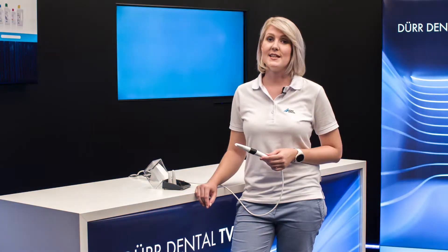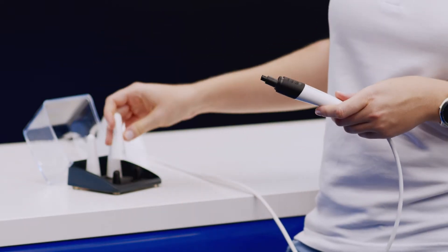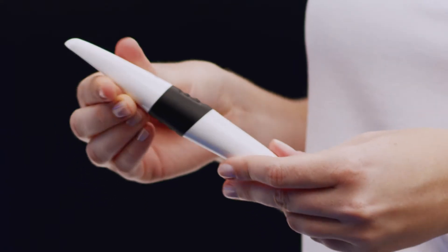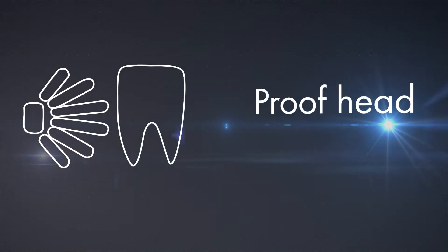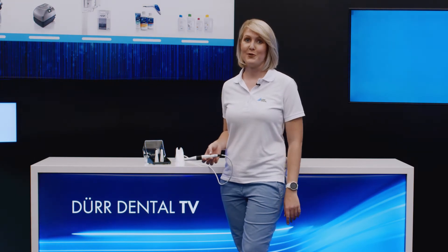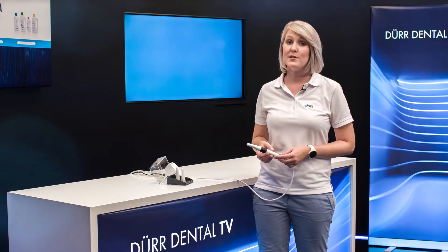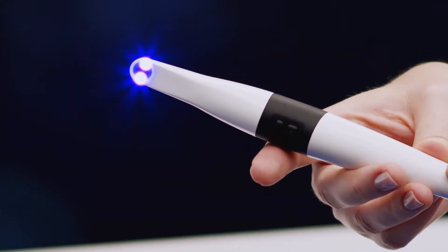The great thing about the Vistacam iX-HD Smart is just how easy it is to change the camera head. Every day your work involves diagnosing caries and being certain about that diagnosis. The proof interchangeable head is a wonderful tool for diagnosing occlusal and fissure caries, especially in children and pregnant women, for whom X-ray images are not ideal.